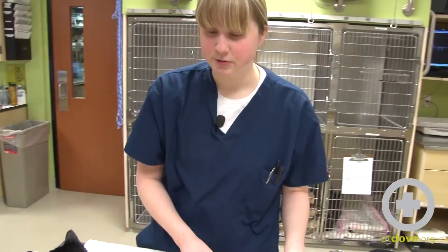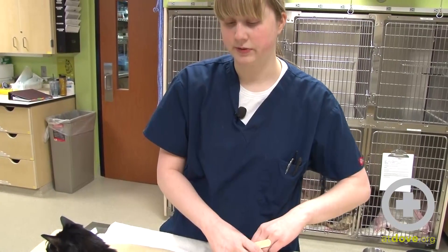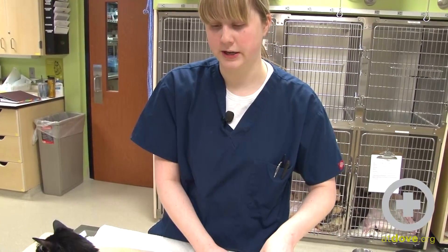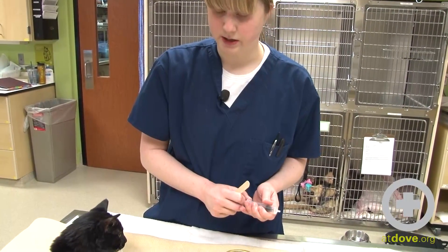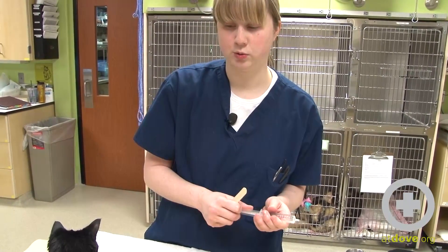The diet I'm going to use for this is Hills AD. It's a very soft diet — it actually doesn't even need to be further blenderized. I'm able to just scoop it directly out into a syringe, and then it pushes very smoothly through these large-gauge tubes.